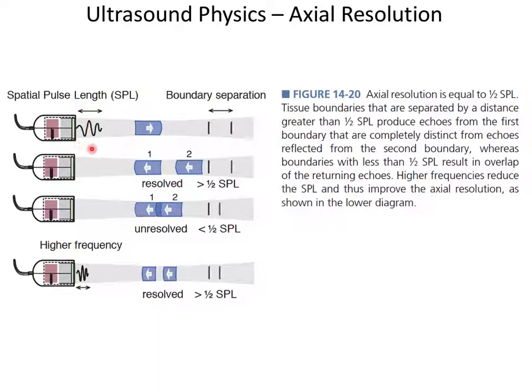So if I shoot this, it's like a small chirp or burst of ultrasound energy. It's like a ping, right? Just as in war movies, when people are in submarines, you always hear the ping, right? That's echolocation for submarines. That ping is a sound wave that has a short time, and it goes out, and they look for echoes from objects, right?